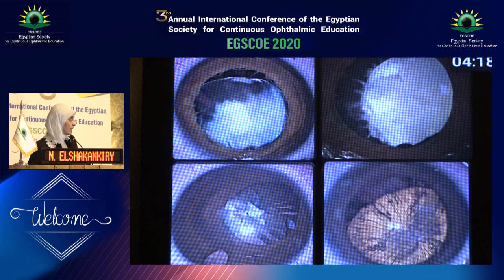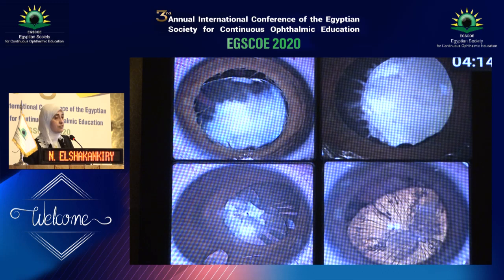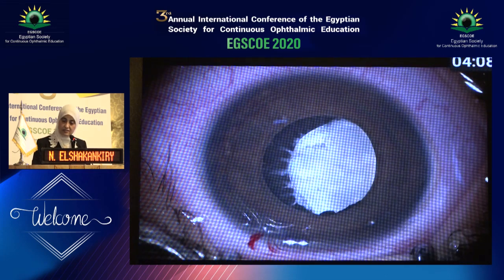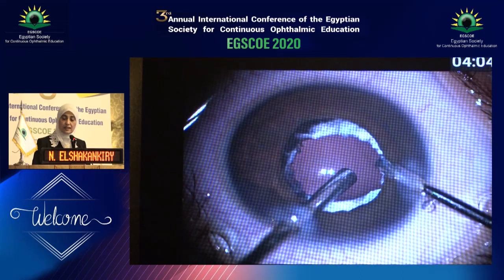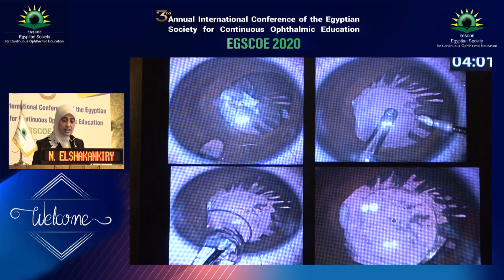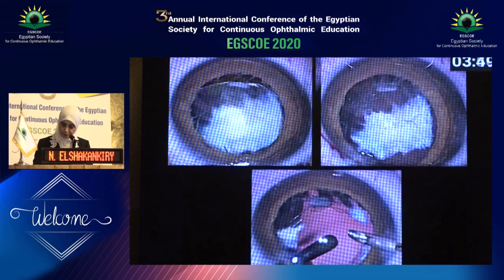And some cases are associated with extensive different morphologies and abnormality in the shape of the lens, even coloboma lens. Again, in these cases, after irrigation aspiration, we clear the visual axis, or we can even implant an intraocular lens. And here at the site of keratolenticular adhesion, this is the place of cleavage between the lens and the cornea.